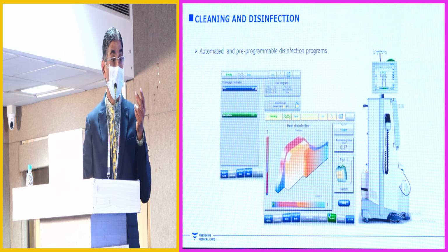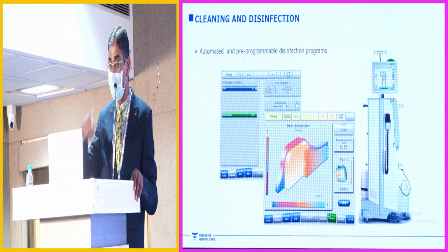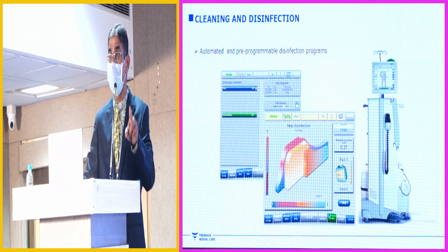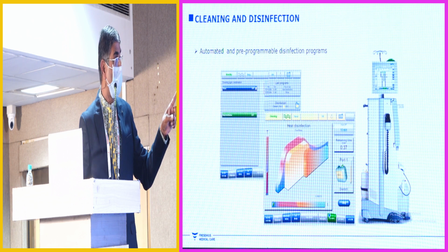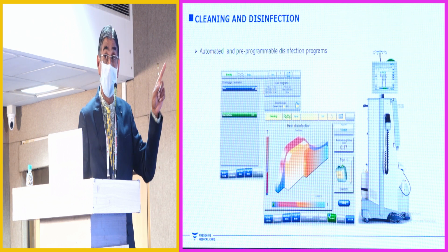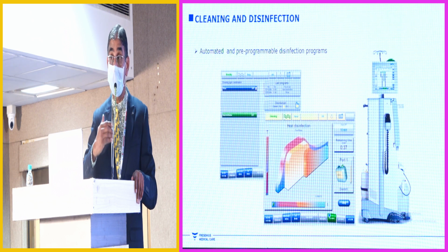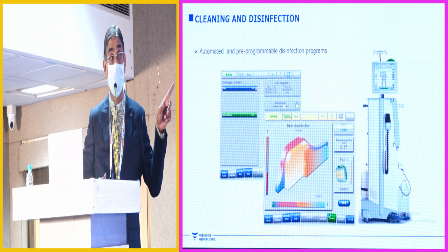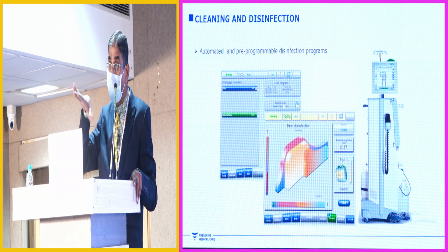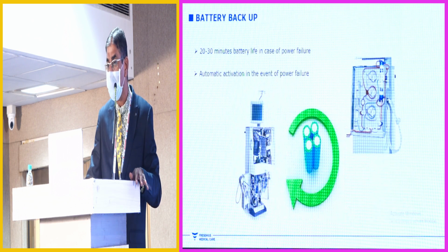The remaining two are lactic acid and malic acid. Malic is the one you see in the apple: you cut it and leave it, and after 3 to 5 minutes it will become golden yellow in color. So when I walk into the dialysis unit, I can find out whether they are using the right disinfectant from the dialysate line, which is golden yellow in color. Then I know they don't have lactic acid or the right disinfectant being used. What does the lactic do? Lactic will also act as a disinfectant, and it lubricates, and it also maintains the pH.